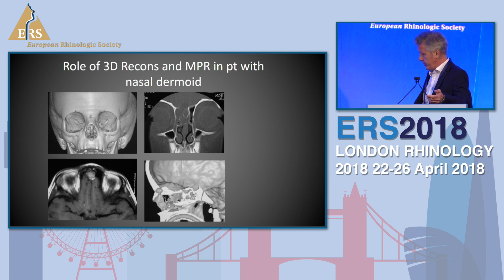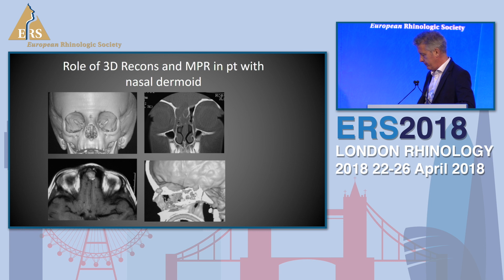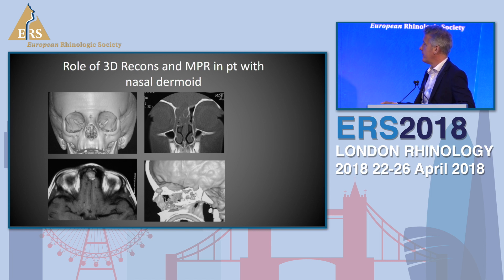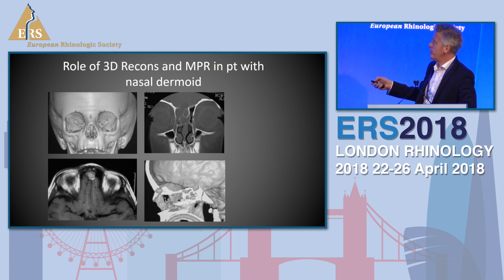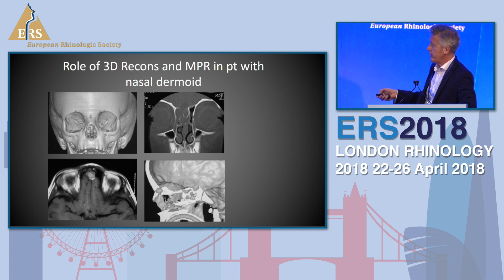For example, this patient with a nasal dermoid - you can use the combination of 3D to see the nasal defect, the coronal CT to see the normal anatomy, and the sagittal reconstruction to see where the position of the dermoid is.